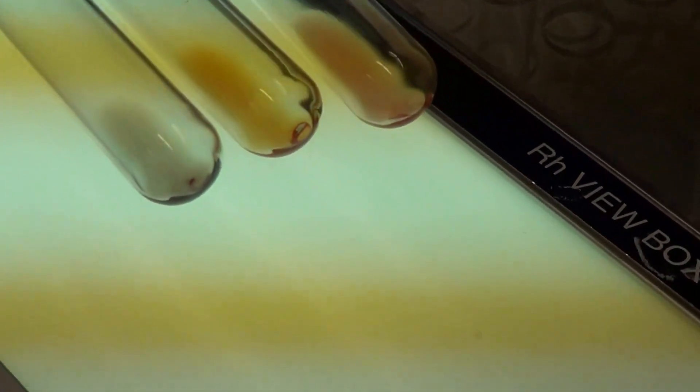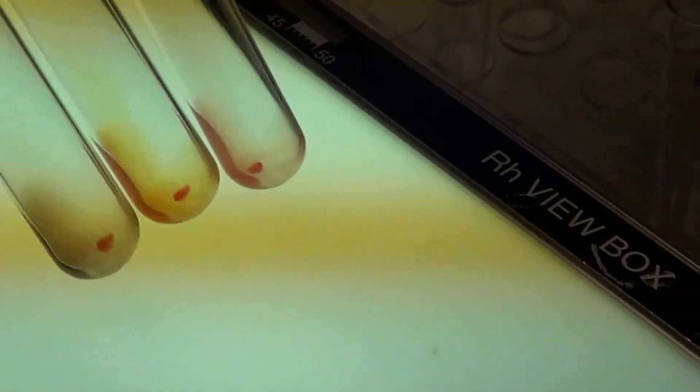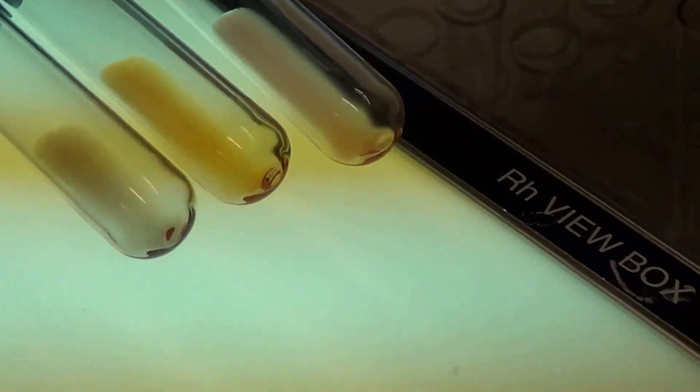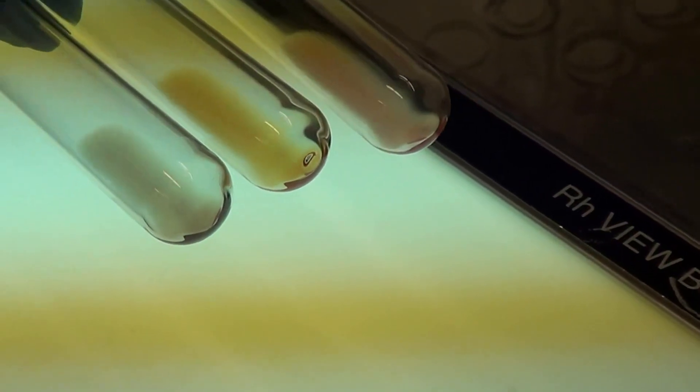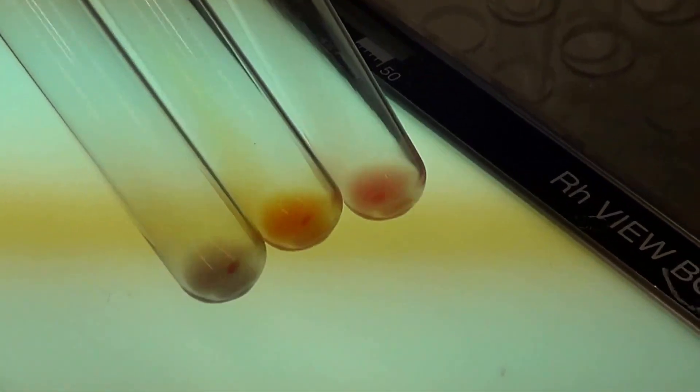There is no agglutination present in these test tubes, therefore they do not have the A antigen or the B antigen. This person would be type O.